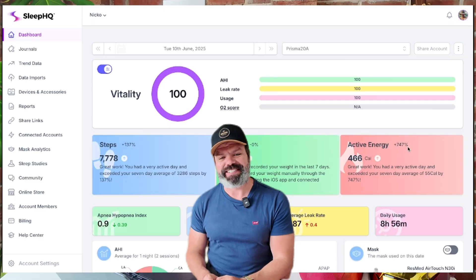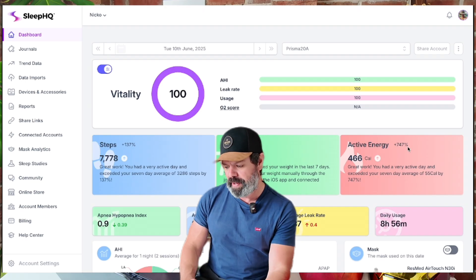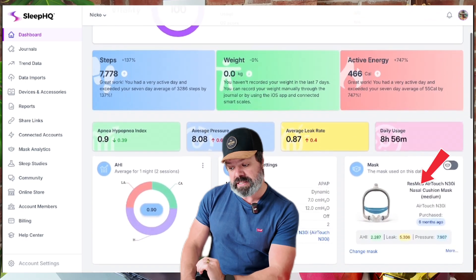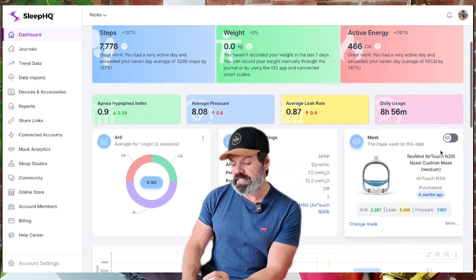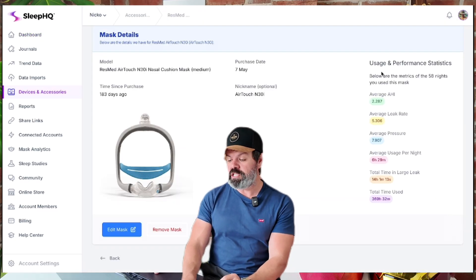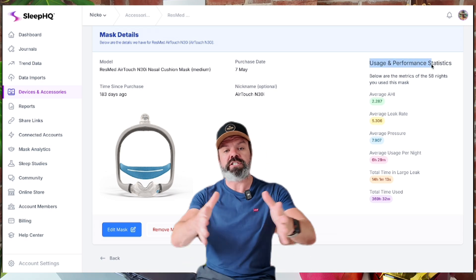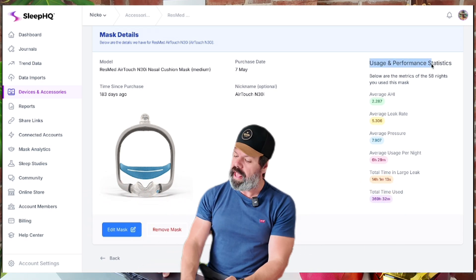And you can compare these results against your own mask performance right here on Sleep HQ. Let me show you how it works. So here we are on the Sleep HQ therapy dashboard. I've got all my CPAP information, and my mask analytics here from my AirTouch N30i. If I tap 'more' here, you can see usage and performance statistics averaged out over the time period I've been using this mask.